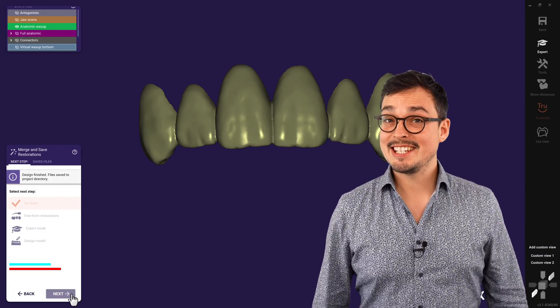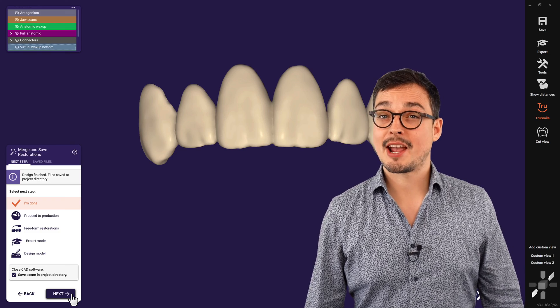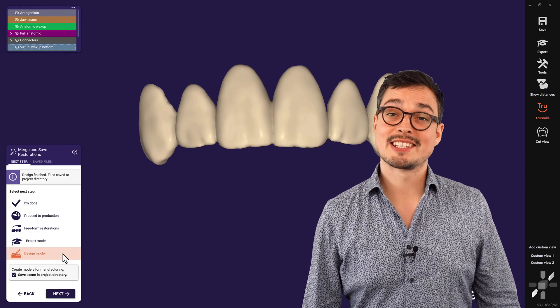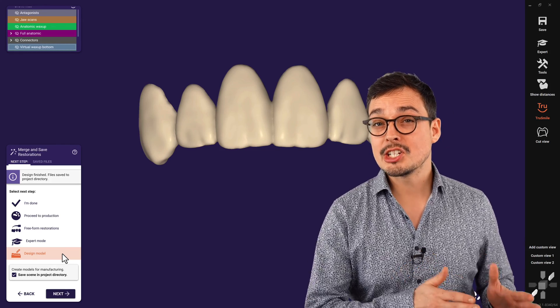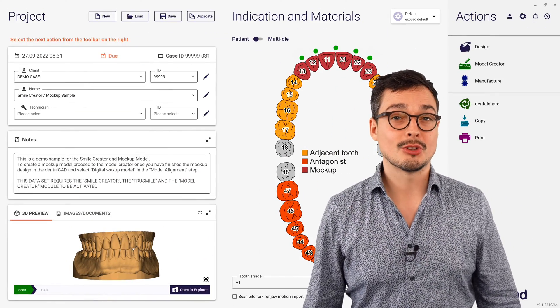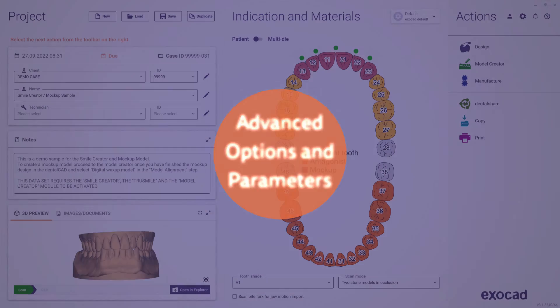That was an easy and intuitive workflow. We will show you how to create a 3D printed physical mockup model in a separate video tutorial. But if you'd like to learn more about additional options and parameters, stay with me and have a more detailed look into it — advanced options and parameters.